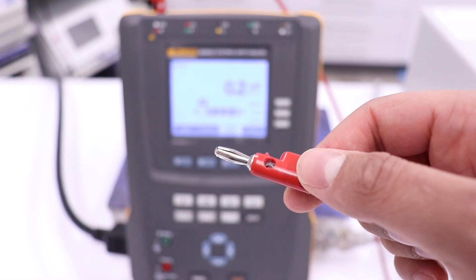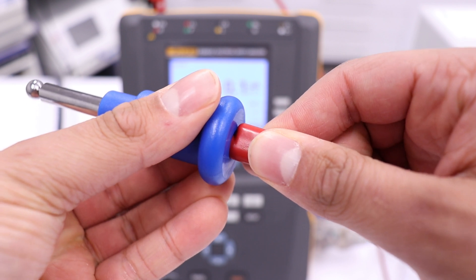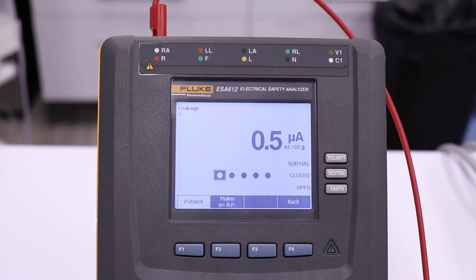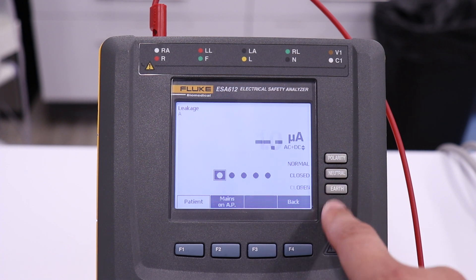Unplug the test lead from the argon receptacle and attach the monopolar test adapter. Plug the test adapter into the monopolar receptacle on the GI-4000. Test for normal polarity, closed condition, and single fault, open earth condition.